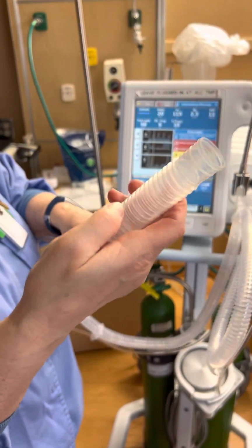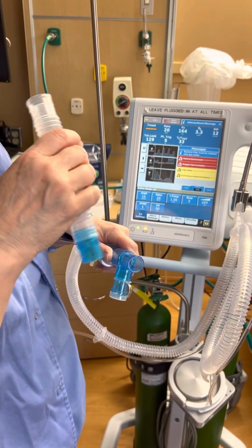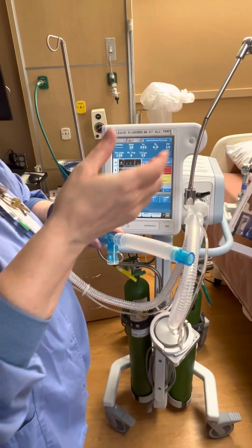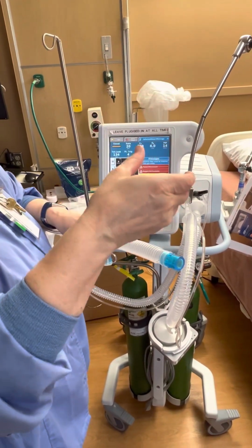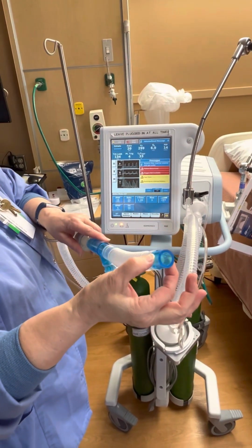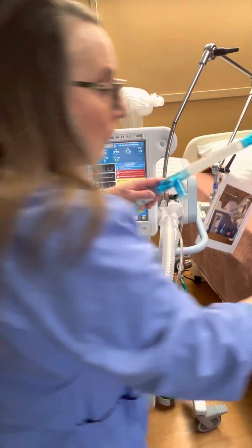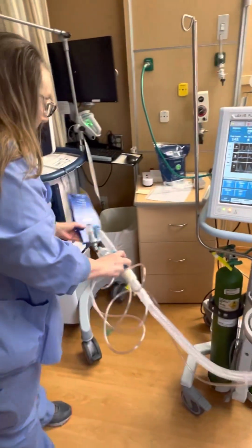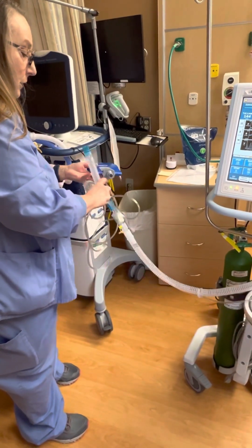I like to use the hose from the neb because it gives me a little bit more kink, because when you do a neb, you don't want it tipped. You want it straight up and down so it nebs better. And then you got a small cuff on the end. So once you have it like this, I'm going to put this back on my so-called patient so it doesn't alarm.